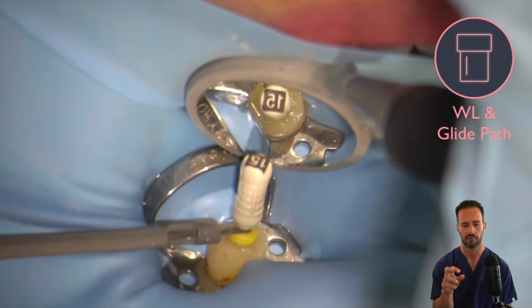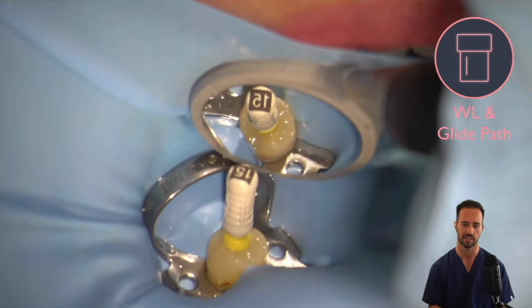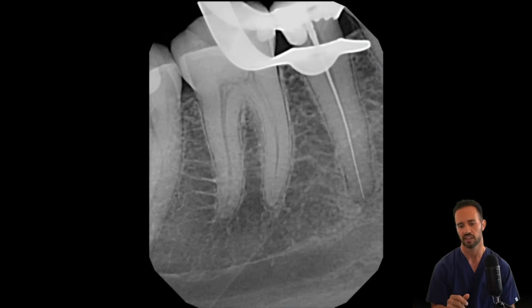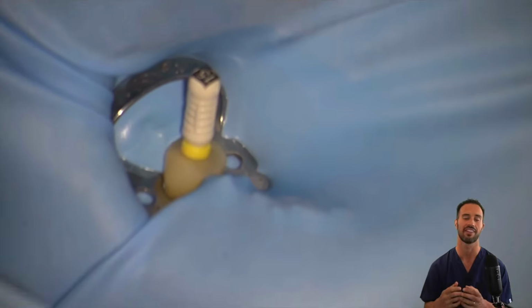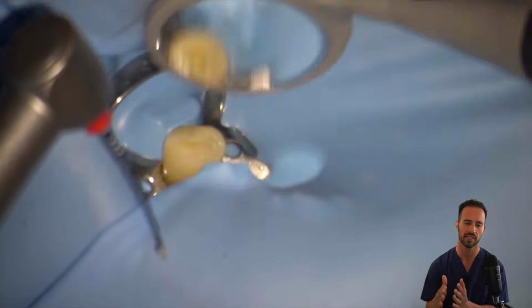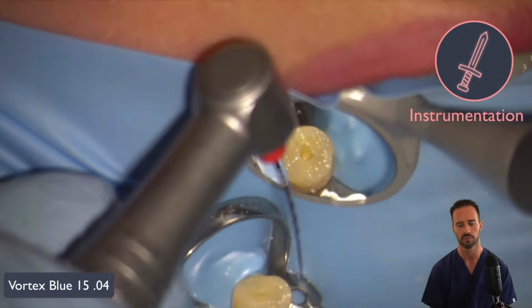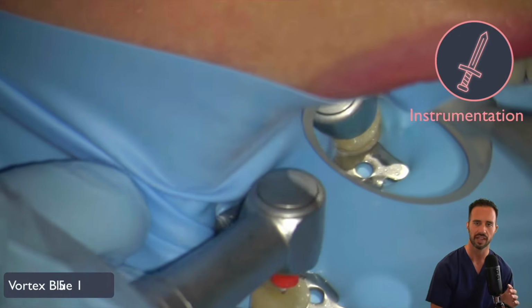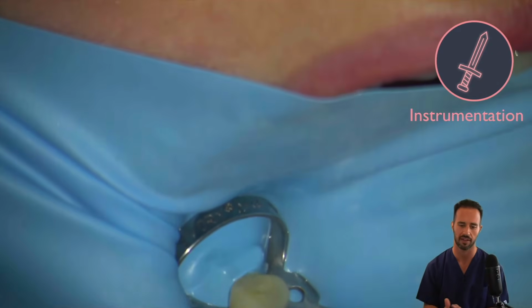All right, I'm finding here that the working length is 23 millimeters. So we're going to take a working length radiograph here, and you can see very clearly that that goes right to the apex, and I feel really good about that working length at 23 millimeters. So now we're going to proceed to our instrumentation phase, and we're going to start with our Vortex Blue 15/04 rotary file, and we're going to take it all the way down to 23 millimeters, and we're going to start working our way up the ladder.